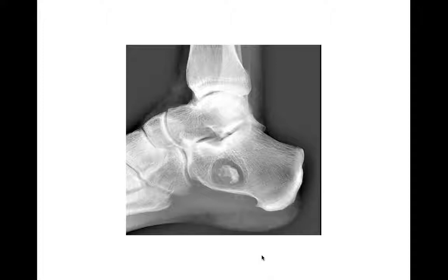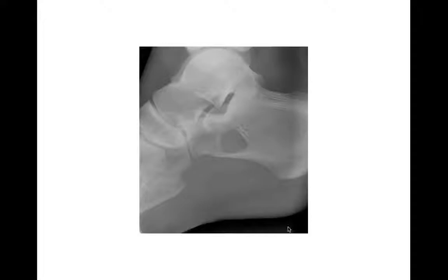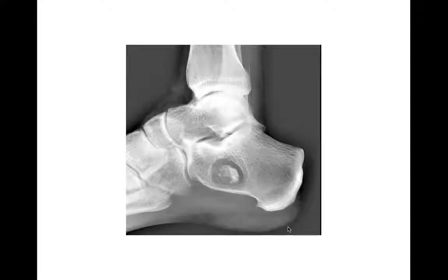Occasionally you can get faked out — it's not really a lesion at all. You may see something that looks like a lesion, but it's a trick of the eye from the trabeculation pattern, which creates a pseudo-lesion. That's easy to prove with a different view or CT, where you'd see the trabecular pattern creating an optical illusion of a lytic lesion when there's none really there. So really think of unicameral bone cyst or interosseous lipoma.